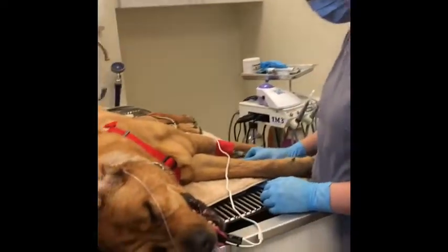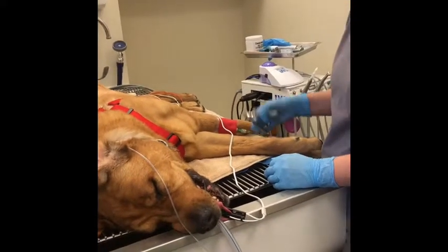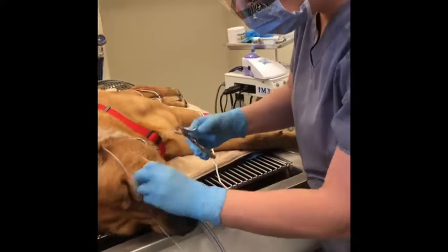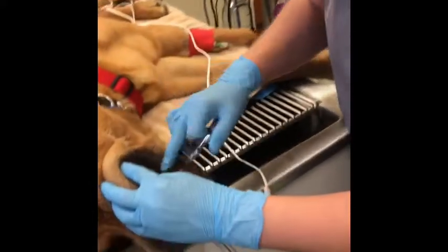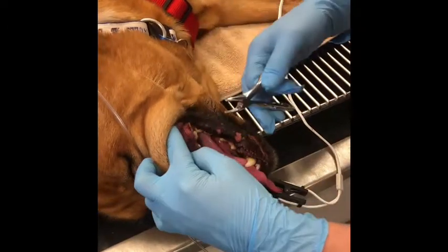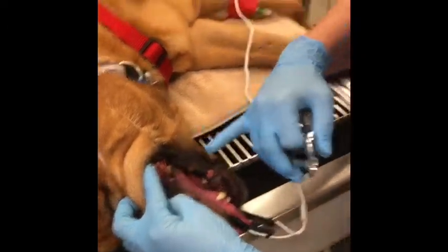So we're going to go ahead and start with our cleaning itself. Usually we would break off any kind of thick tartar with some tartar pickers or grabbers, but basically he doesn't really have any that needs to be done, so I'm not going to mess with that right now.